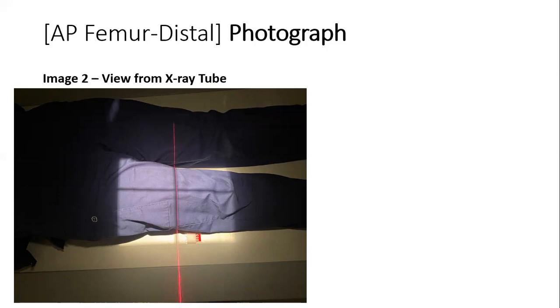The collimation field size for this image should be closely collimated on both sides to the femur, with the end collimation approximately around the film borders. The appropriate marker location for this image is that our marker should be placed on the image receptor inside the table bucky or on the tabletop, so long as it does not show up inside the needed anatomy that we are imaging.